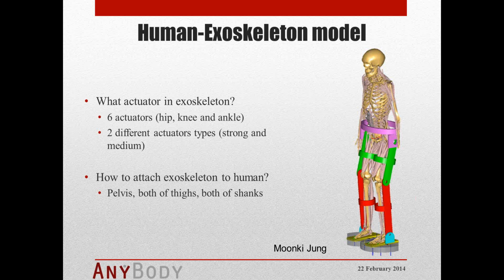So in order to attach the exoskeleton to the human, in our case it was attached at the pelvis, both thighs and both shanks, and we fixed those kinematically, and kinetically, I hope I get it correct now. So the weight of the exoskeleton was carried by the exoskeleton itself, but all other forces were basically then attached to the human.